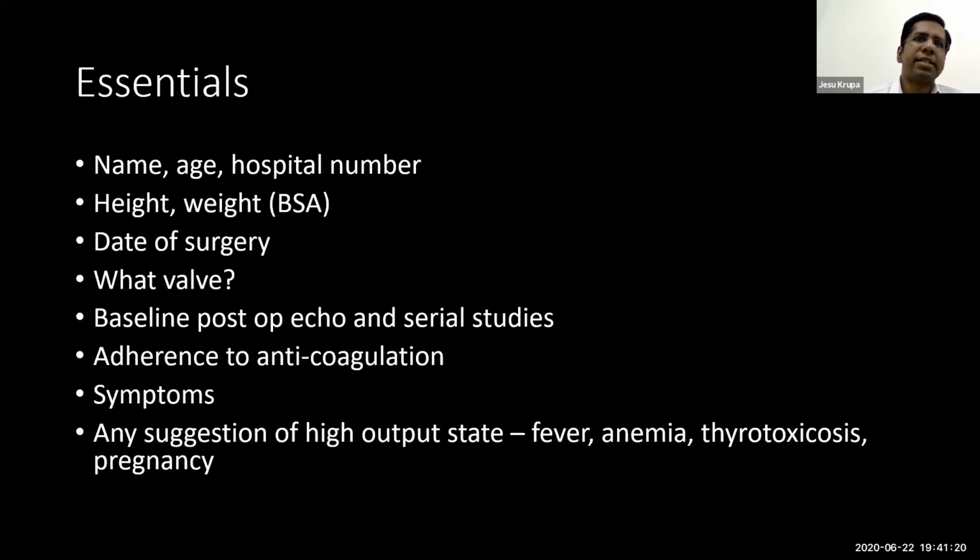Certain other conditions may occur a little more remotely. So that is why date of surgery is important. What valve was implanted is also extremely important. And you will see why as we go through the cases.